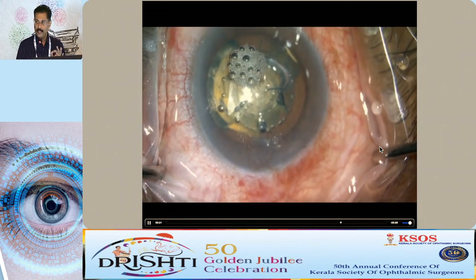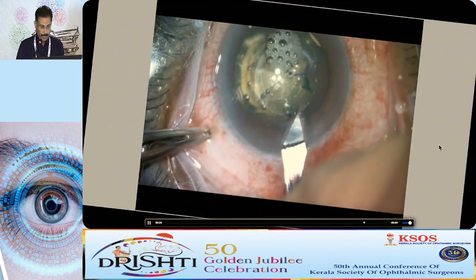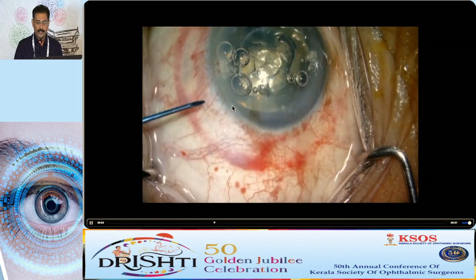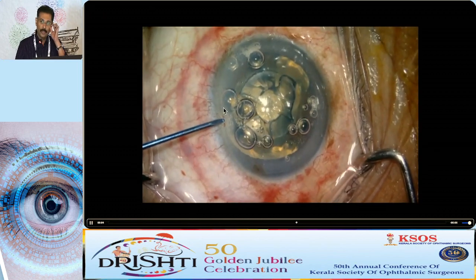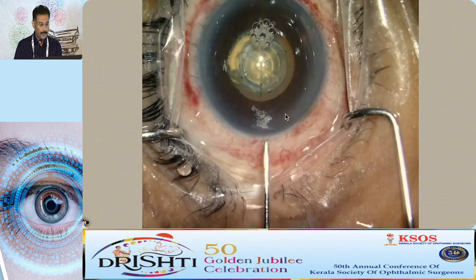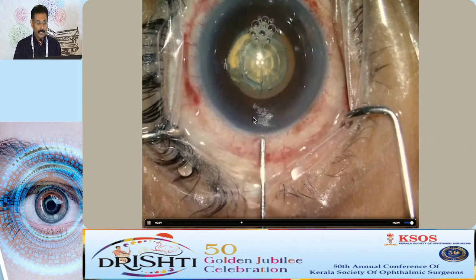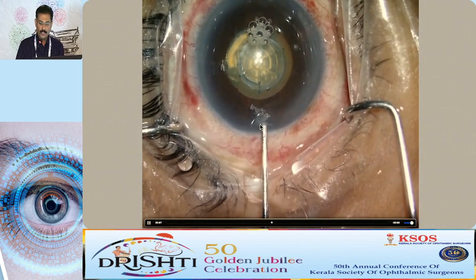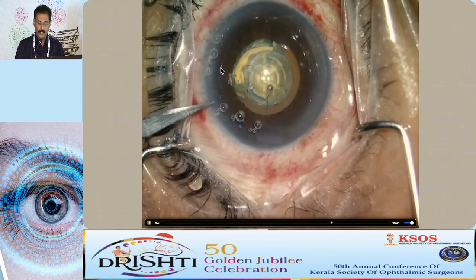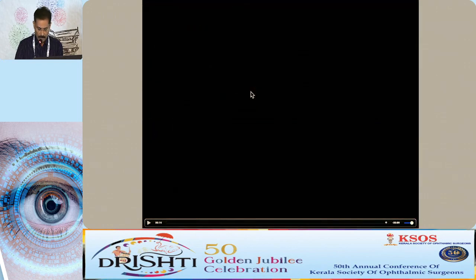So if it is definitely uncut, use your keratome to extend it to the adequate size. And sometimes, mostly when you do right eyes, you will see superior arcus like this, where femto cuts do not work. So in such a case, always use your blade to open it up. And here again you can notice that this cut is too anterior into the clear cornea, the paracentesis. So this is so easy to open if cut well. So it just like that opens, but this one I would just abandon it and make a peripheral paracentesis and go ahead. Otherwise it will be difficult to manipulate through these instruments.